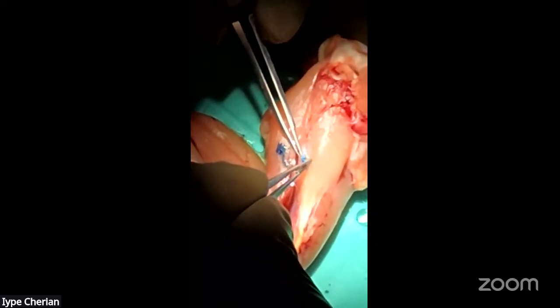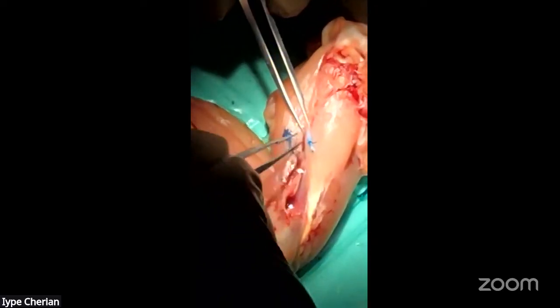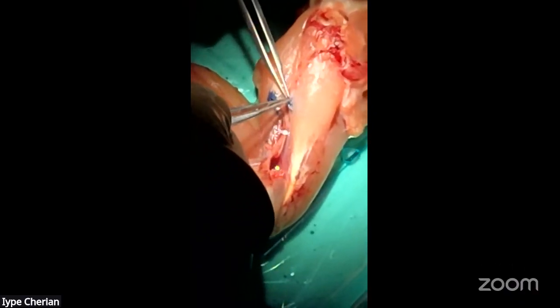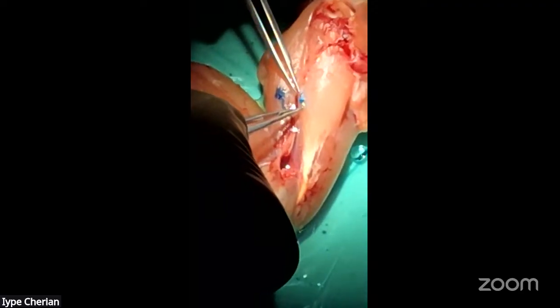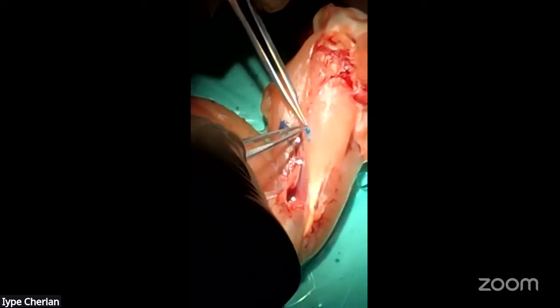And I'm using a smartphone camera. That's the amazing thing about this. It's a good camera. Imagine if we are able to use smartphone cameras for these kinds of things rather than the microscope camera.